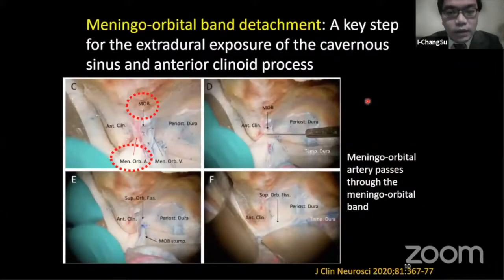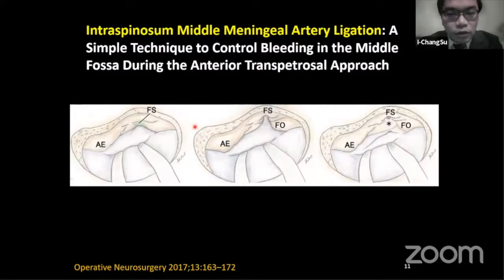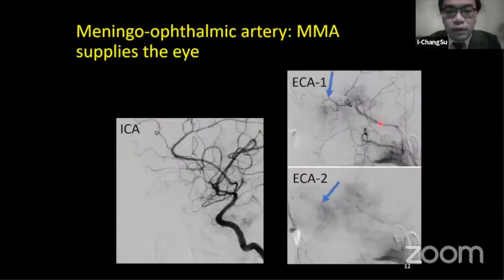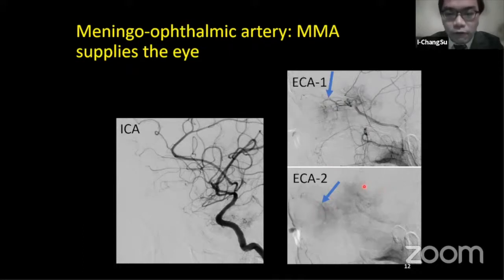We all know that it's a key step to divide the branches of the middle meningeal artery during certain skull-based approaches. For example, meningoorbital band detachment is a key step in anterior clinoidectomy, and this step will inevitably divide the meningoorbital artery, which is a branch of the middle meningeal artery. Similarly, in the anterior transpetrosal approach, it is also a key step to divide the middle meningeal artery at the level of the foramen spinosum. However, it is possible that the patient's ocular supply or the ophthalmic artery is not coming from the classical ICA, but is coming from the middle meningeal artery, as seen in this angiogram, with the choroidal blush visible from this ophthalmic artery. This kind of artery that supplies the eye is called the meningoophthalmic artery — the same artery that we will divide when we attempt to detach the meningoorbital band.